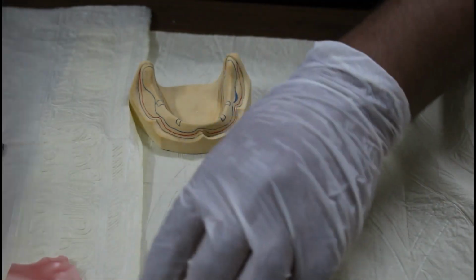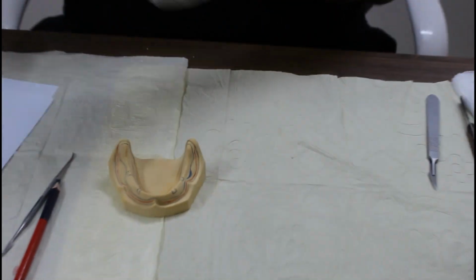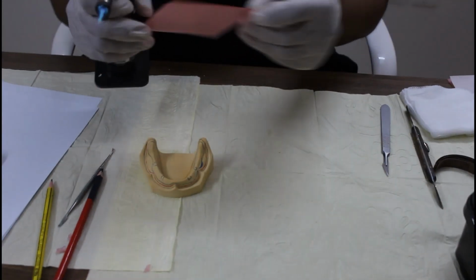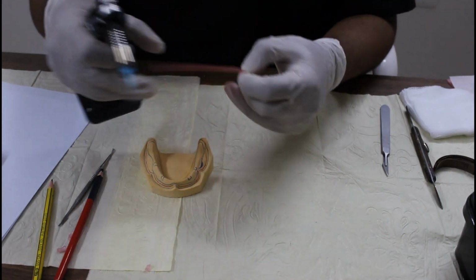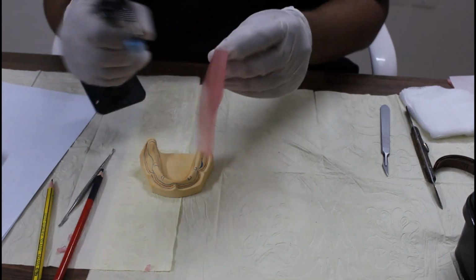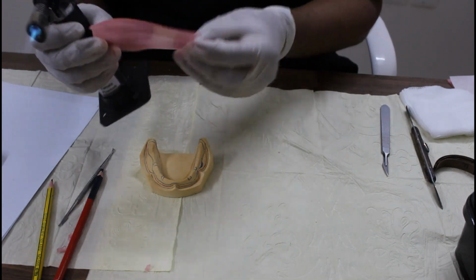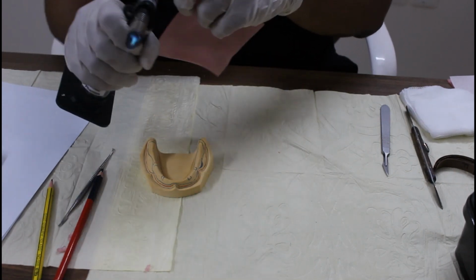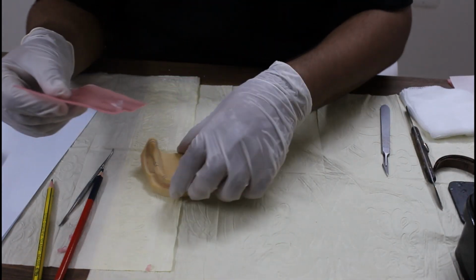Take your wax sheet, make the wax slightly softer. Do not melt it, just make it soft. Keep on rotating it. Be careful, don't burn your hand and fingers, especially when you are wearing gloves. So it has become slightly soft.